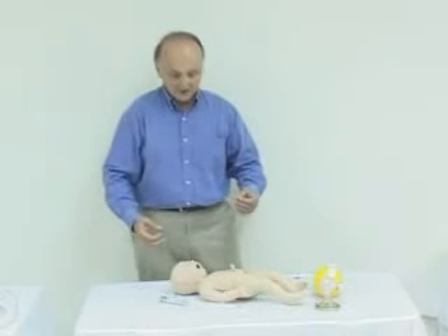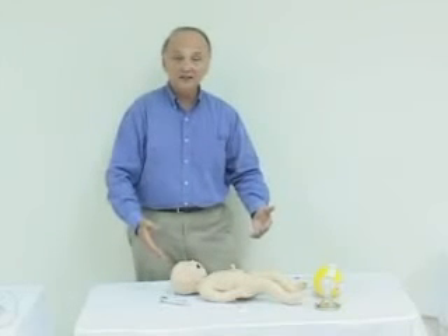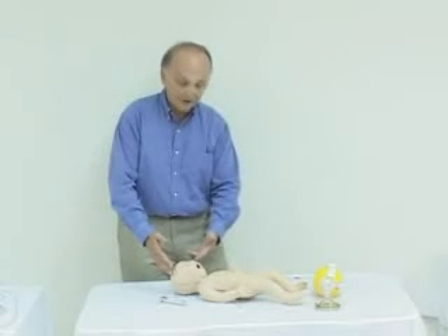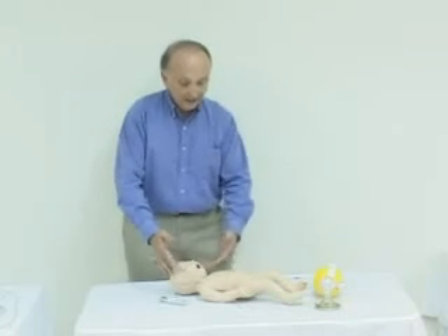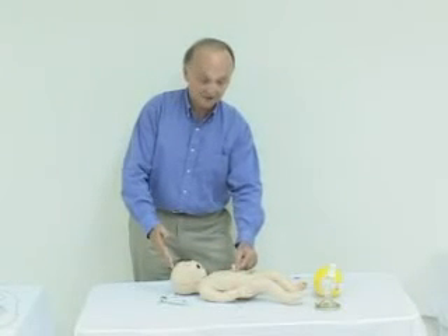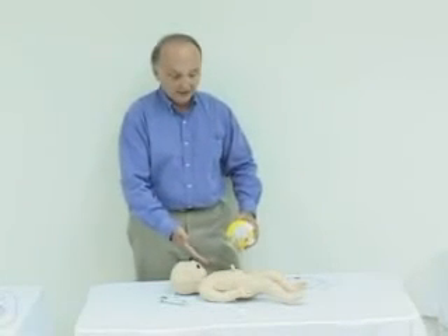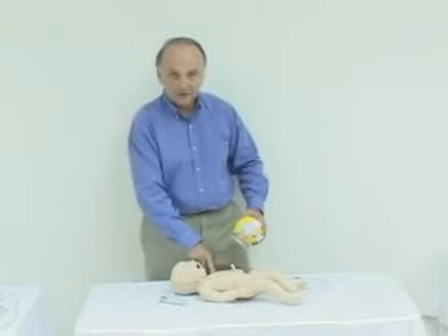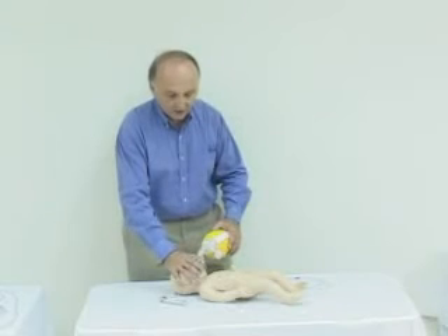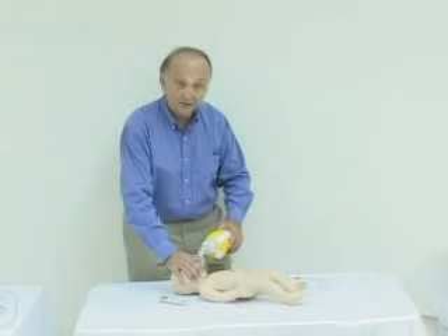Now that Noelle has delivered the fetus, let's turn our attention to the neonate available in the Model 550. You're able to intubate orally or nasally, of course do BVM and CPR, and provide medications through the umbilicus. The internal upper torso contains a heart, lungs, and ribcage, so you have the anatomical landmarks and very nice chest rise with adequate BVM technique. This neonate is available on the Model 550.